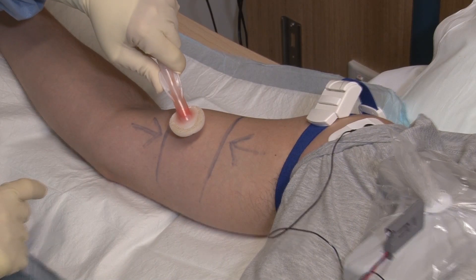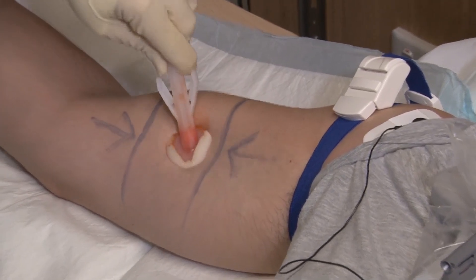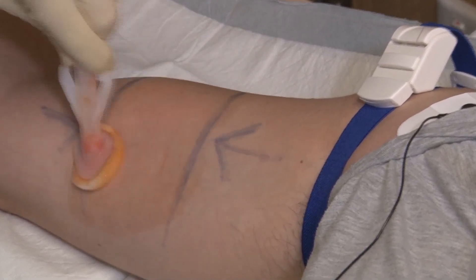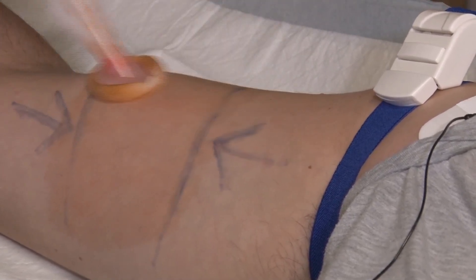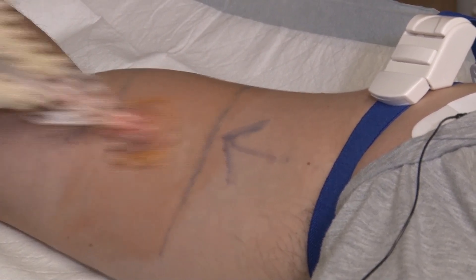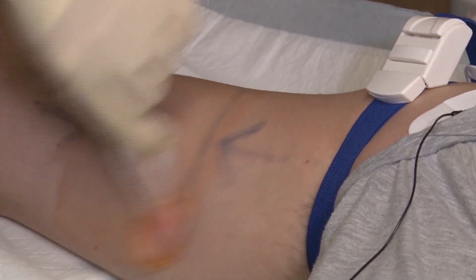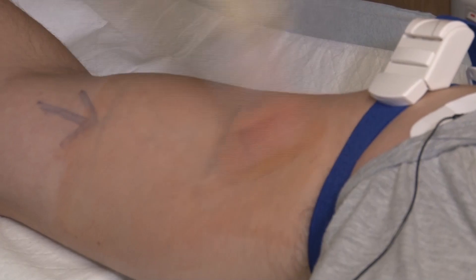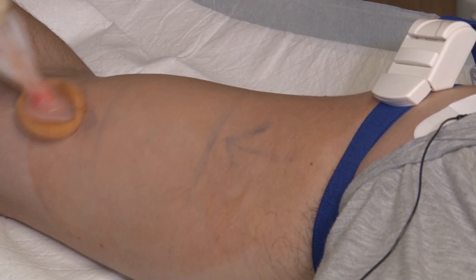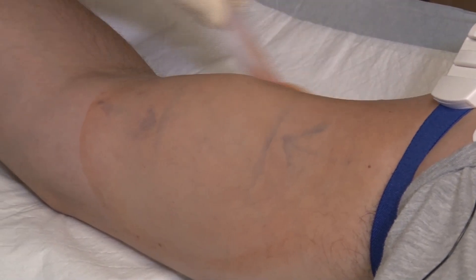Next, the patient's skin should be prepped using antiseptic for at least 30 seconds and allowed to dry. Alcoholic chlorhexidine has been found to be highly effective in reducing central line associated bloodstream infections. Here we are using a sterile applicator to avoid free pour solutions and reduce the risk of inadvertent injection. If chlorhexidine allergy exists, alternate solutions such as povidone iodine can be used.